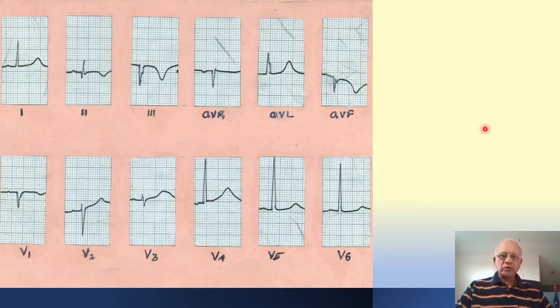Any infarction can produce hypotension. So the patient could have had a transient hypotension as soon as he had the infarction. That could have caused the syncope, one cause. Also, there could be transient atrioventricular blocks in patients with inferior wall infarction. It could go from second degree block to even a transient complete heart block, which could revert to normal quickly. So that also can produce syncope.